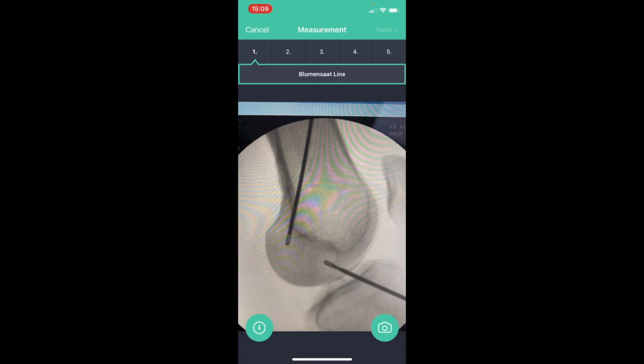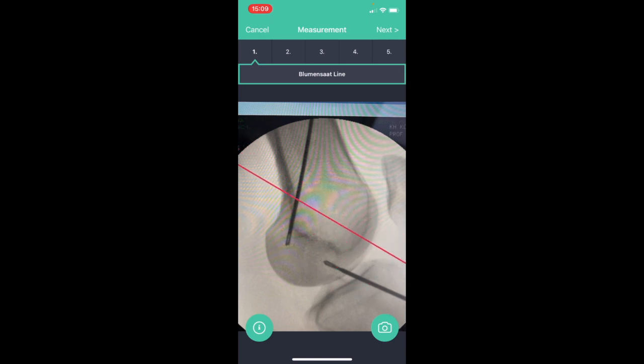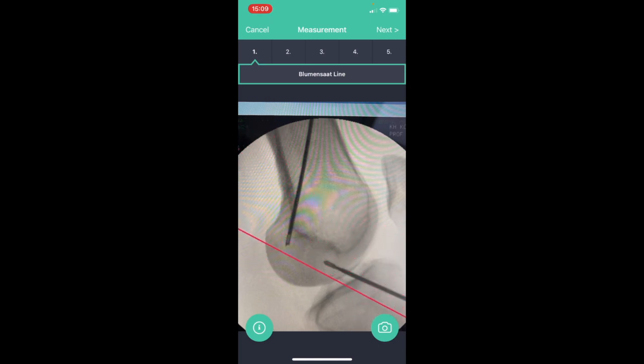Now I can touch the screen with my index and middle finger and I can establish a red line which I can move anywhere and turn it in any direction. Now I make sure that the red line perfectly overlies the Blumensaat line.